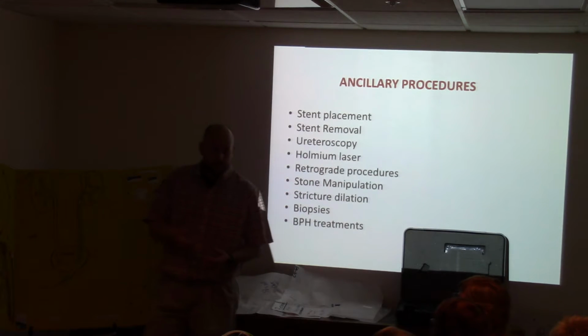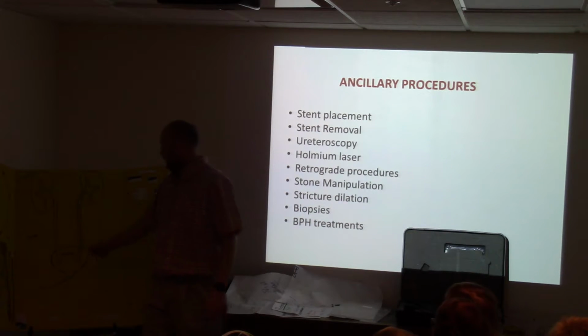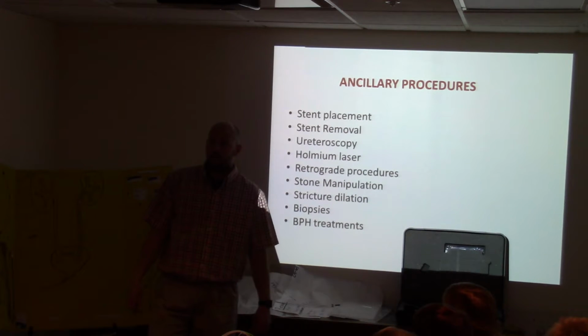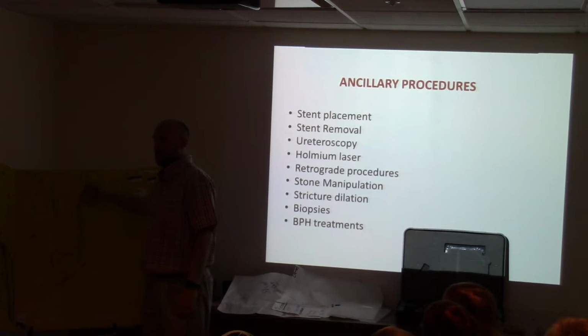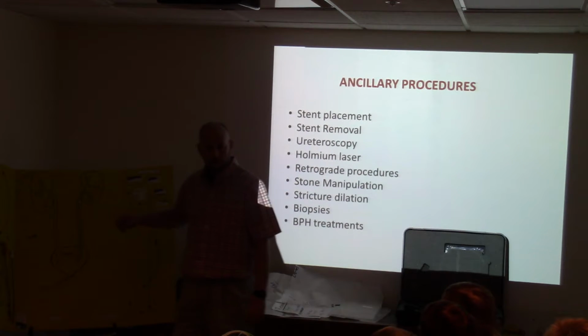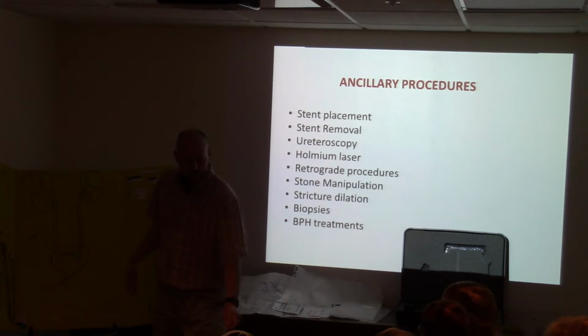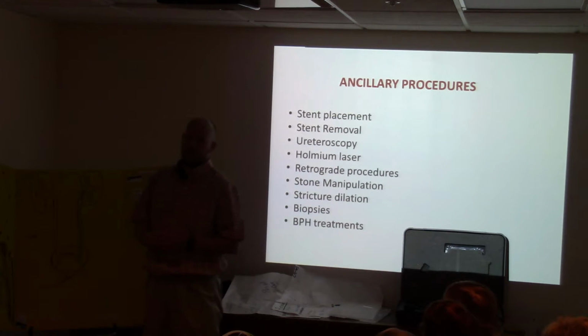And if the doctor tries to pull the stent out, what happens a lot of times is it'll snap in half. And you'll only get the bottom part out, and then they have to go up surgically and remove it. Sometimes we could treat them along the whole stent with shockwave just to break enough stone away, but it very rarely works because there's so much stone at the circle part of it that's in the kidney up there. You just can't get enough of it away.